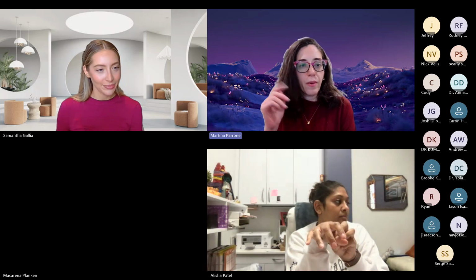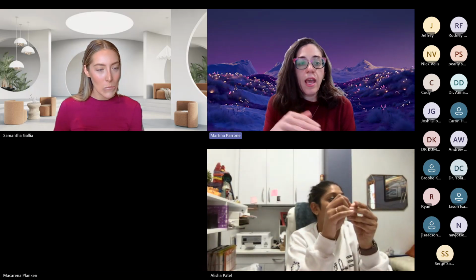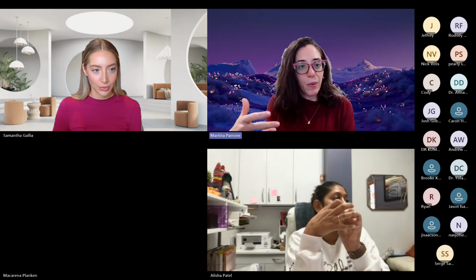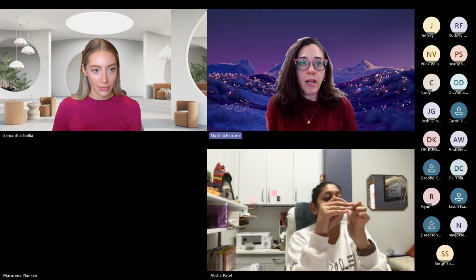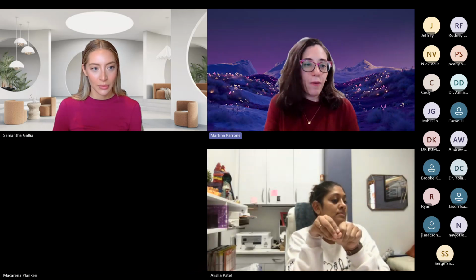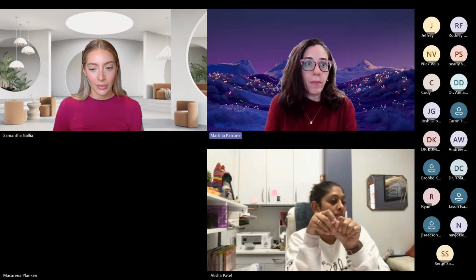I know Samantha went over the TMJ. You can't actually see the disc, and that is absolutely true, but we can infer a lot of information by looking at the bony osseous components and how they relate to one another. Sometimes we will say in our reports, if you have to know where the disc is, then get an MRI. But if you're taking a scan for other reasons and it's included in there, we can often give you a lot of information about them as well.